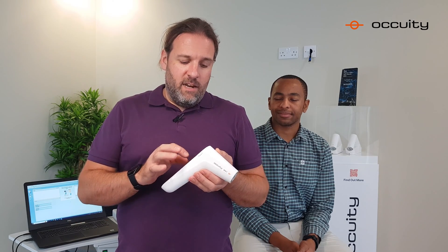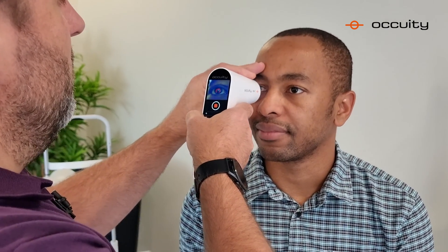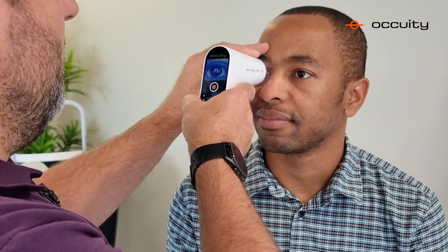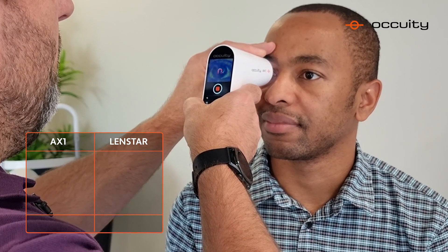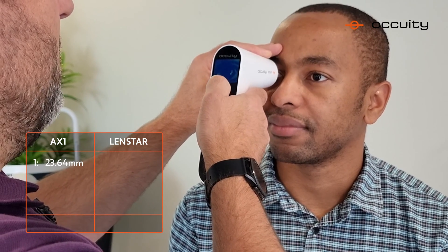The AX1 is a hand-held device, very simple to use with the touch screen on the back. You simply put it into measurement mode and offer it up to the patient's eye. The device automatically recognises when it's aligned and starts scanning, and automatically recognises when it's made a good measurement.